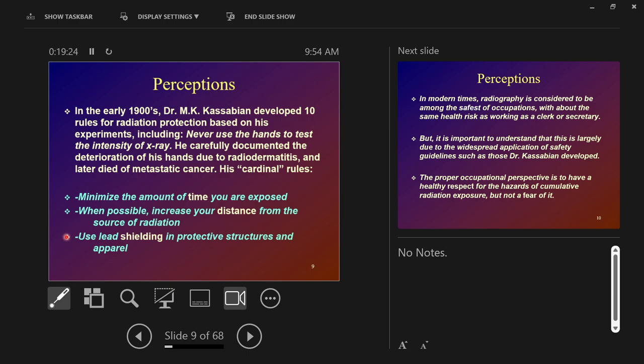Even after we filter, in our modern machines, do we still get low end x-rays? You'll get some. You can't perfectly filter the x-ray beam. You can decrease the amount of those low energy photons by passing the x-ray beam through the filters, the aluminum filter, the glass of the x-ray tube. So you're decreasing the amount by a lot. You're not completely eliminating all of the low energy x-rays. But it's a drastic decrease in exposure to the patients when that filtering is done.